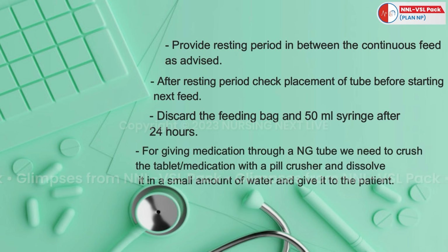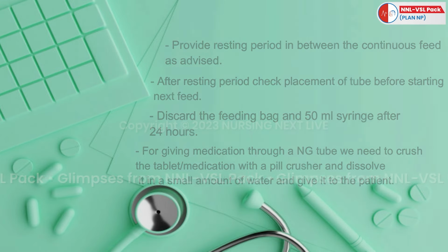Eighth, for giving medication through an NG tube, we need to crush the tablet or medication with a pill crusher and dissolve it in a small amount of water and give it to the patient.